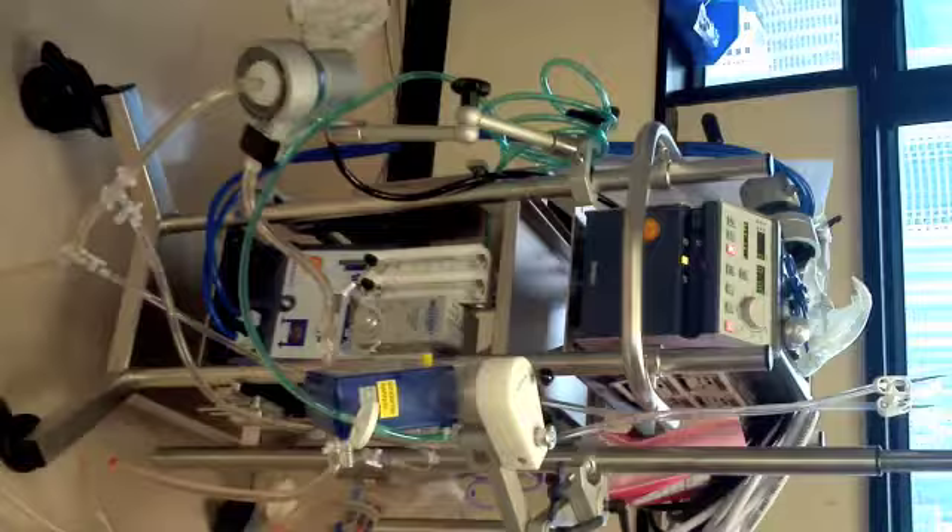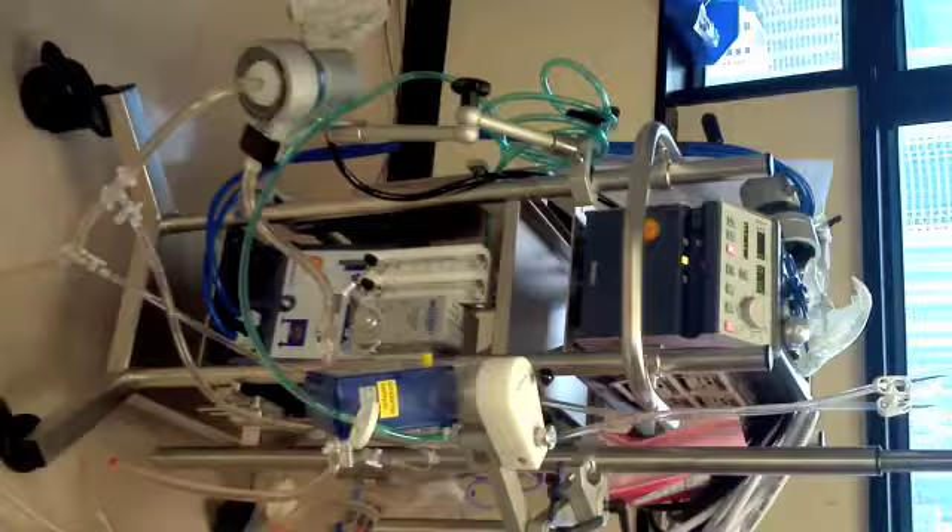Priming is finished. We can stop the pump now. Finally, let us revisit all the components in the rotor flow circuit.